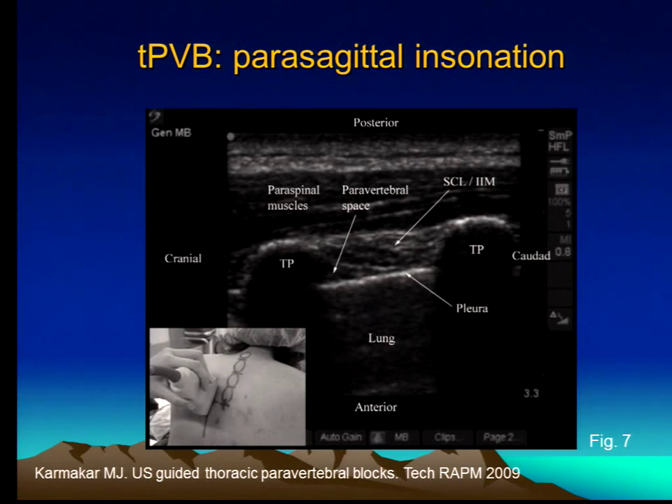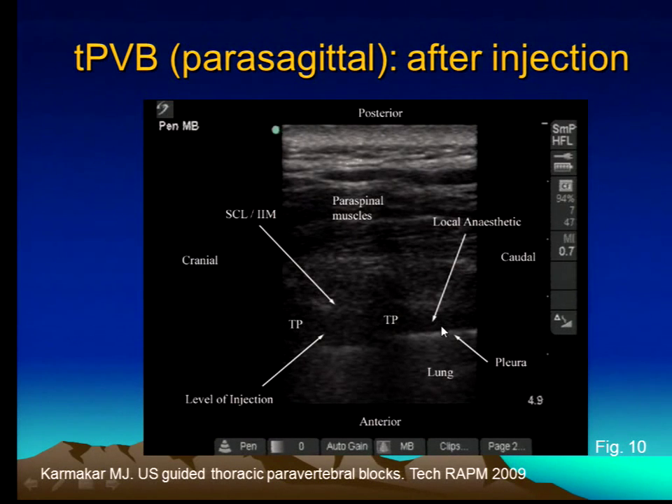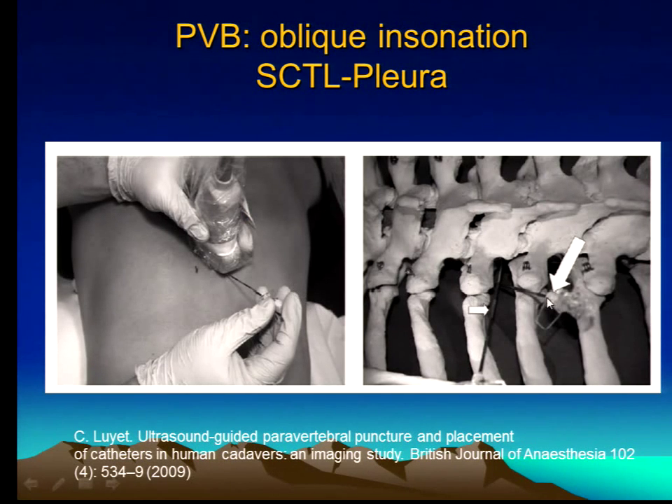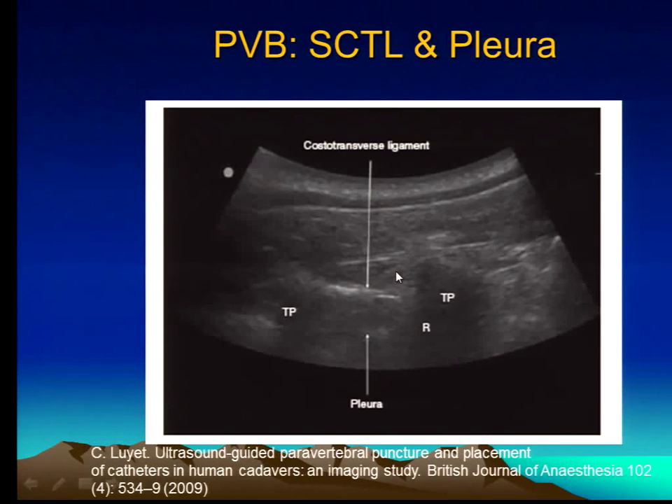When I do this technique, I inject some fluid, and my endpoint is the depression of the pleura. You oftentimes can't see the tip of the needle very clearly, in large part because of the angulation of the needle relative to the transducer, but you can always see the depression of the pleura. Here's a nice picture where you can see the space — it's a small, very thin hypoechoic area, probably no more than two millimeters, and incredibly close to the pleura. So your target space is very, very narrow. The local anesthetic increases the space, and you can see how it gets thickened.